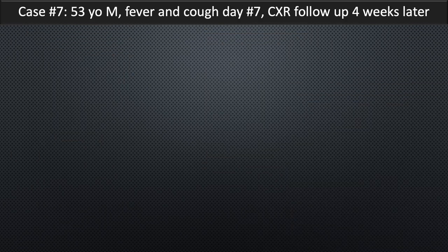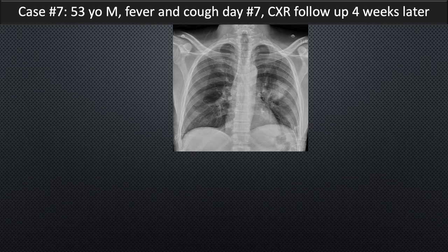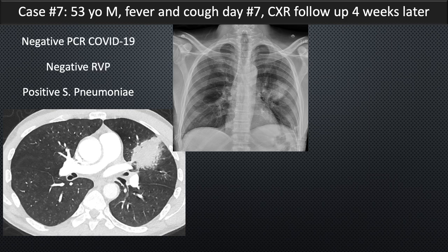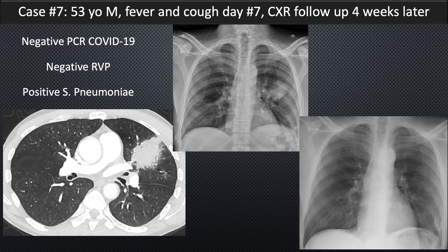Case 7: a 53-year-old male presenting with fever and cough on day seven. A chest radiograph demonstrates a dense focal consolidation in the left upper lobe with no other pulmonary abnormality. This pattern is statistically more likely a bacterial infection. The patient tested negative for COVID-19 by PCR, negative on the respiratory viral panel, but positive for Streptococcus pneumoniae. He was treated with antibiotics and sent home. Follow-up approximately four weeks later demonstrates complete resolution of the consolidation — an alternative diagnosis of bacterial pneumonia.